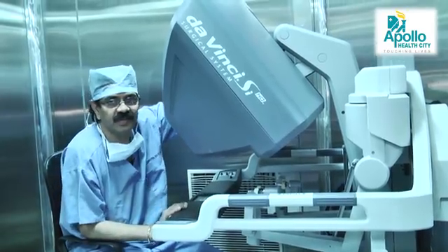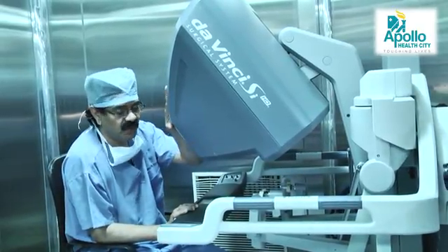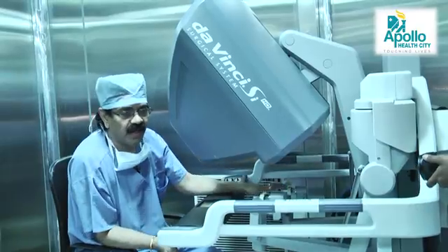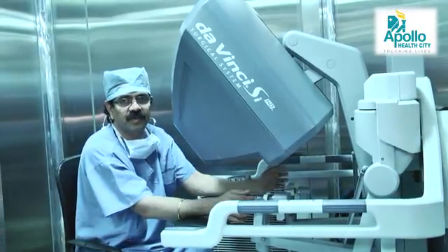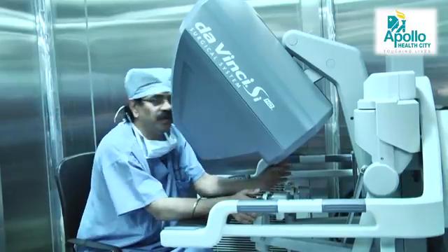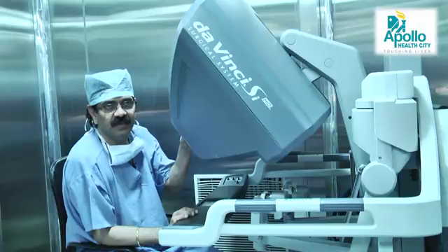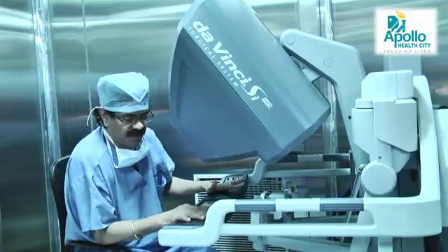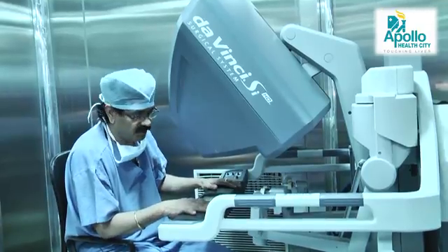What I am showing you now is the surgeon's console. It has a vision area, a hand area, a leg area, and foot controls. This is the area where the main vision is performed — you peep inside and it provides a three-dimensional view. This is the arm rest where adjustments for the entire system can be programmed.